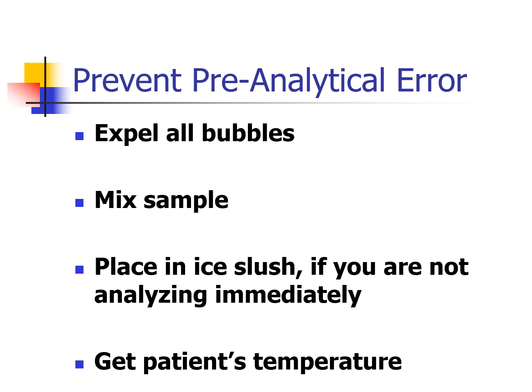We're going to place it in a sort of an ice slush. Like I said, when you go to do the blood gas, you're just going to have this little baggie that's going to have a little bit of ice in it. And by the time you're done drawing the gas and the sample, it should be a little bit slushy, especially if you're not analyzing immediately. Now, if you have the ABG machine within 20 steps of where you're at, that's a whole separate thing, right? We don't want to lose it, but usually most places you're going to still do the ice slush.